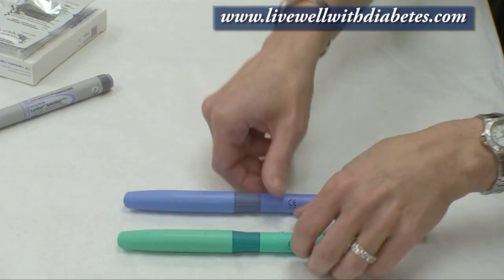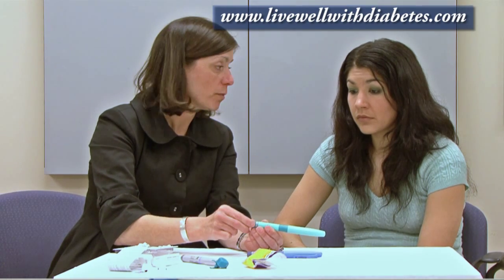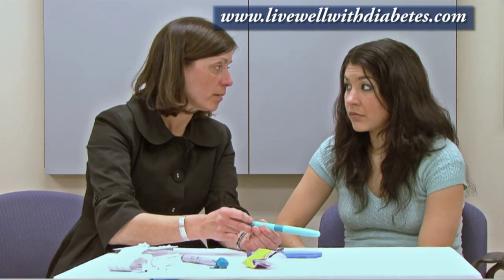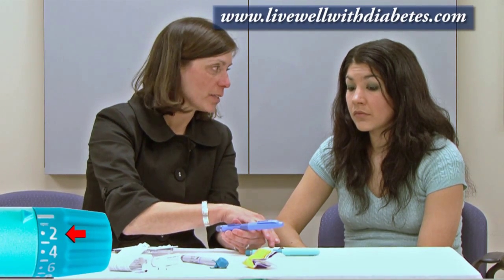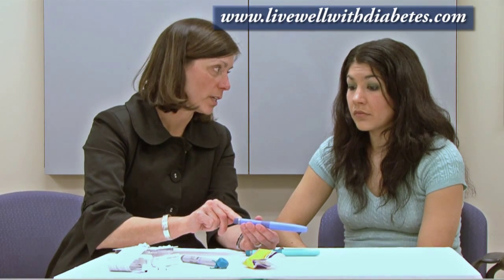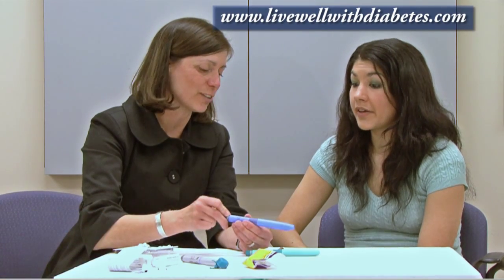The difference in these two pens, besides the color, is that this particular pen only dials up to a maximum of 21 units and changes by one unit increments. This other pen dials to a maximum of 42 units but changes by two unit increments, so you can only go by even numbers: 2, 4, 6, 8, 10, 12.